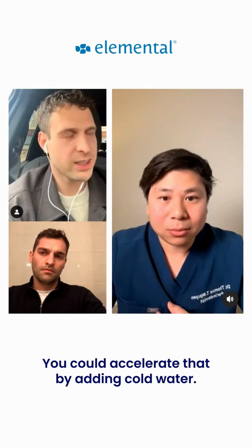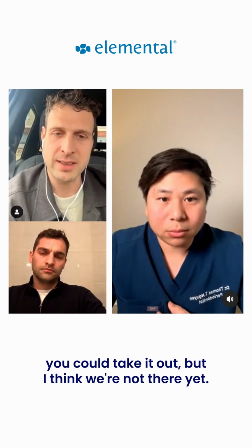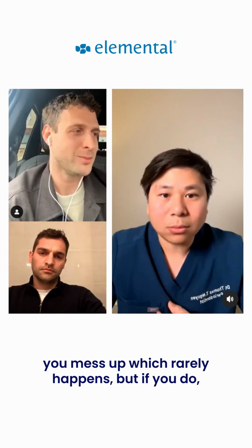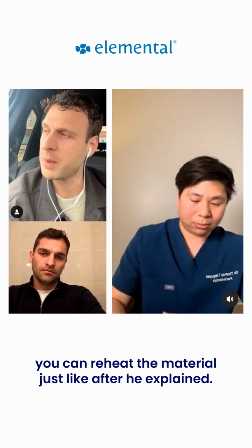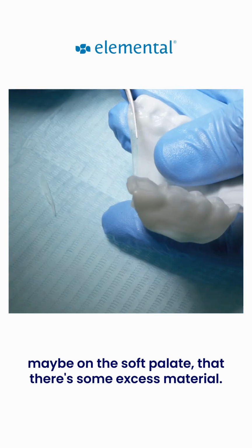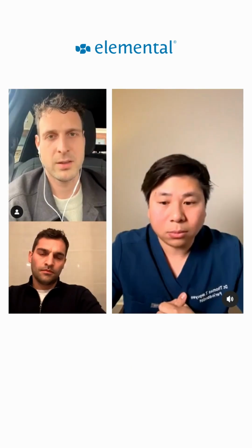In a clinical setting, you could accelerate that by adding cold water. And as it sets, after about 1 minute, then you could take it out. But I think we're not there yet. What's very interesting to know is that should you mess up, which rarely happens, but if you do, you can reheat the material just like he explained. And then also, it could be that on the alveolar mucosa, maybe on the soft palate, there's some excess material. Just cutting the material with regular surgical instruments is also completely possible.